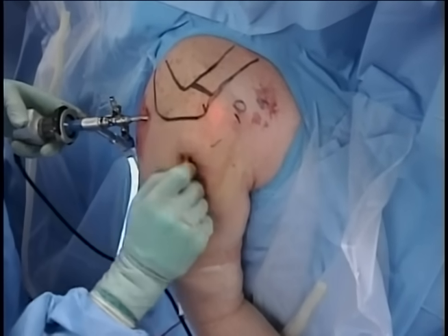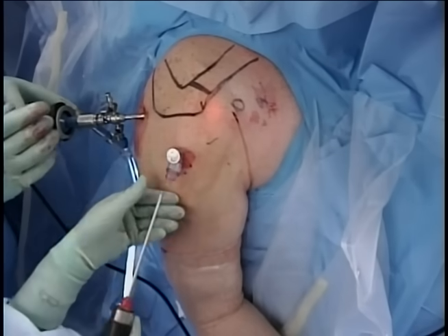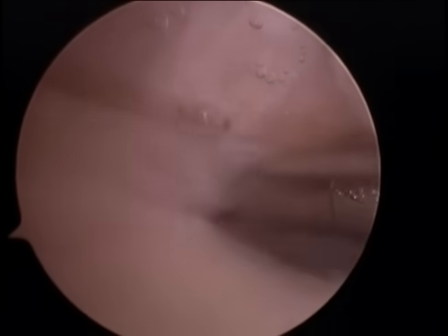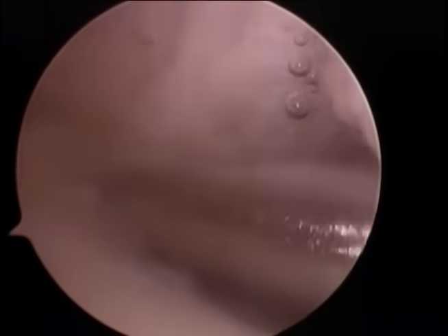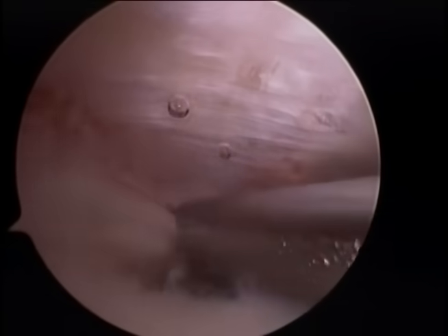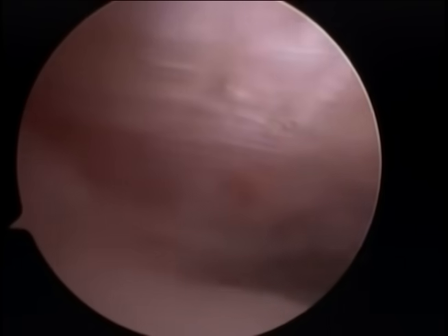a lateral portal. We inserted the same cannula and our shaver to perform a bursectomy. We begin our bursectomy. The fluffy white tissue is the bursa, which we need to clean out in order to visualize. Just above our shaver is the shiny white coracoacromial ligament, which is attaching to the anterior lateral border of the acromion. This is the location of a spur.